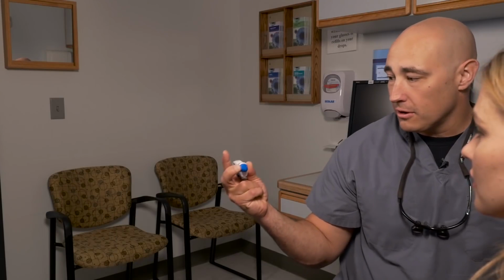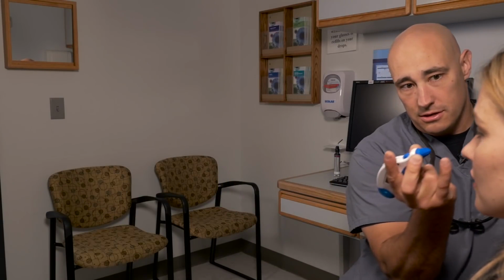Okay. So obviously put numbing drops in. We're not actually going to check Meg's pressure, but I have her look straight ahead. And then the other reason I like to use the Tono-Pen is because you can sneak it in between the eyelids. So even if they're coming in with a swollen eyelid because they've had a trauma, you can oftentimes still check the pressure on the cornea without having to open the eyelids up.